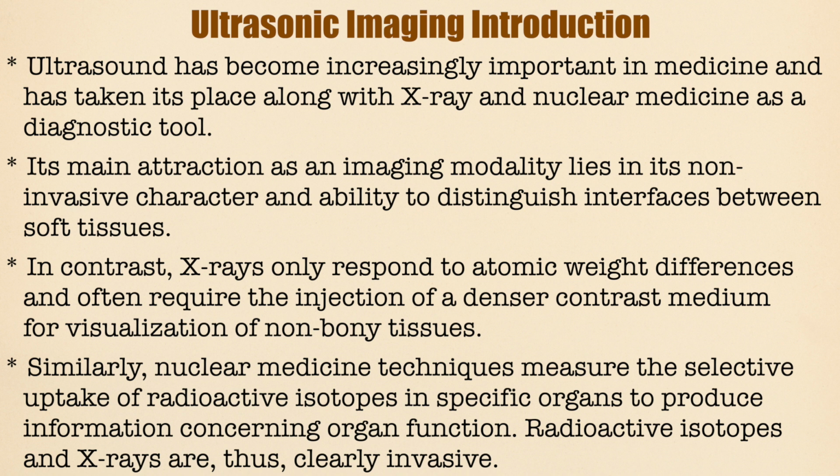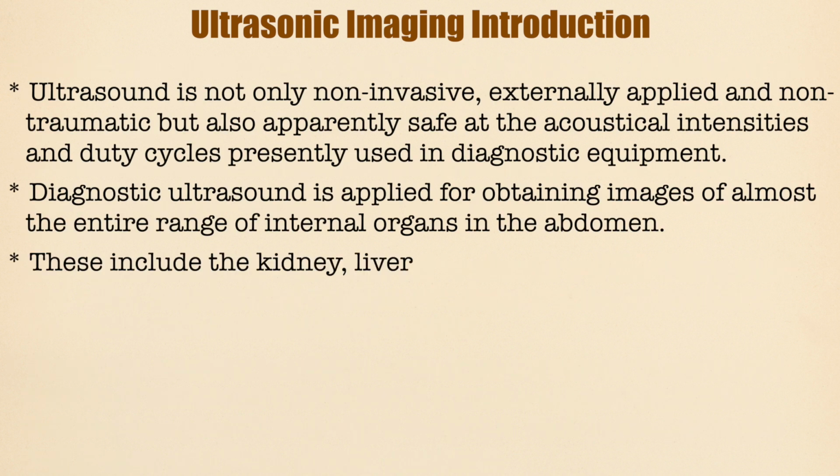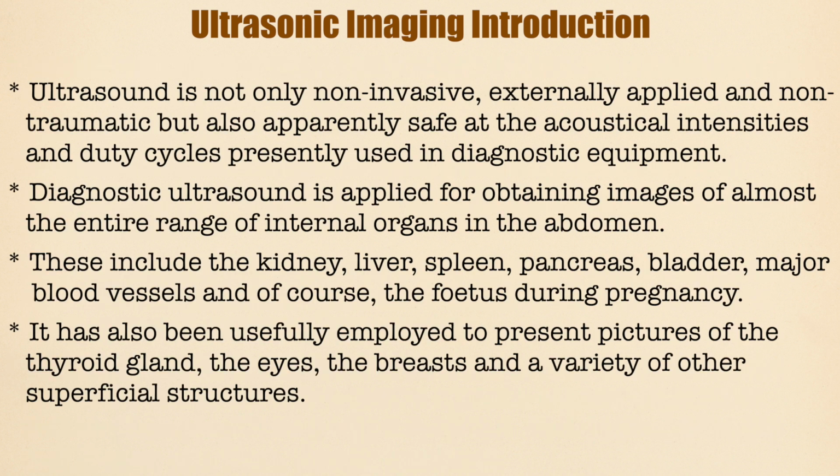Similarly, nuclear medicine techniques measure the selective uptake of radioactive isotopes in specific organs to produce information concerning organ function. Radioactive isotopes and X-rays are thus clearly invasive. Ultrasound is not only non-invasive, externally applied and non-traumatic, but also apparently safe at the acoustical intensities and the duty cycles presently used in diagnostic equipment.